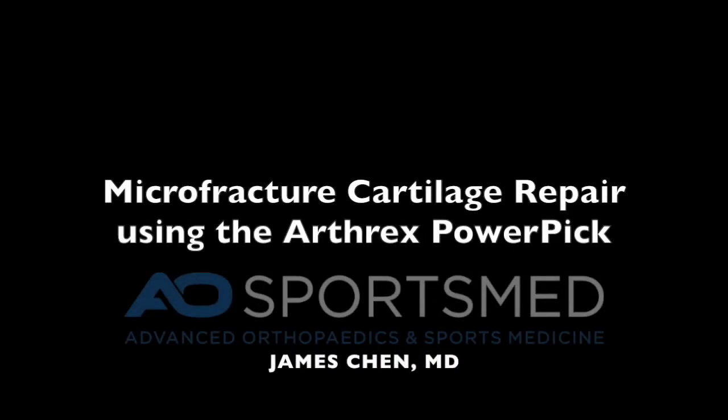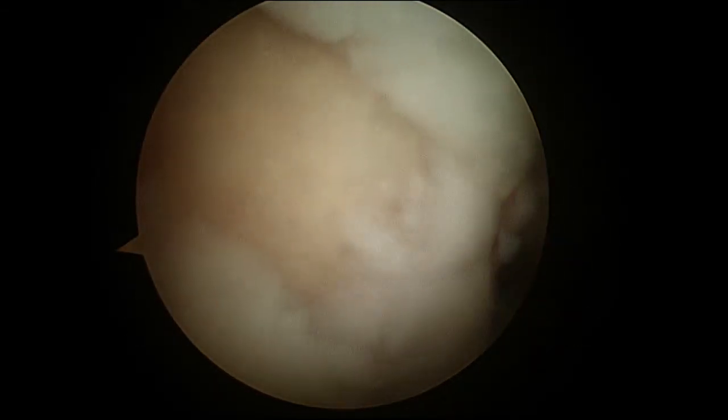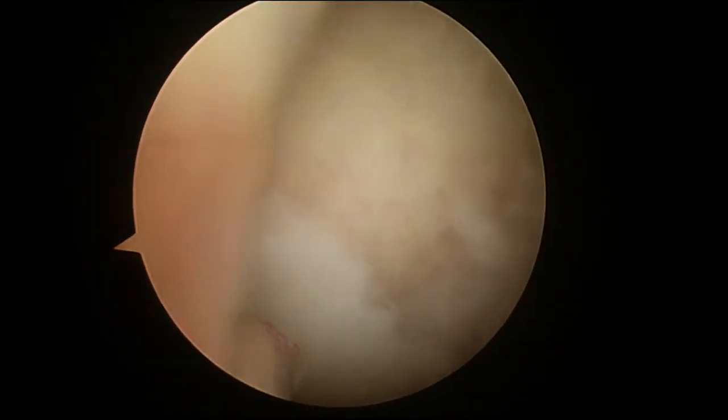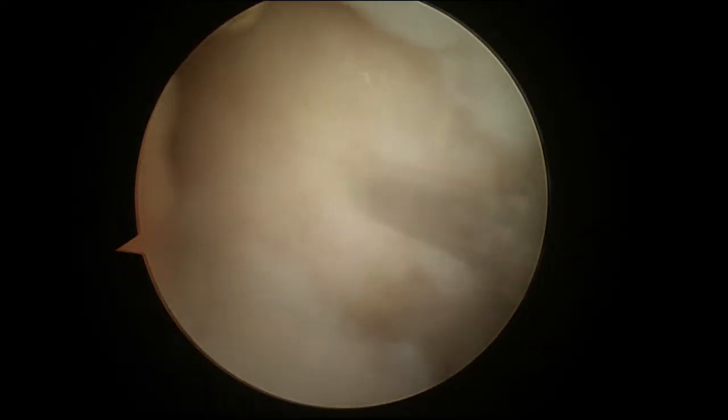This is a technique video on arthroscopic microfracture cartilage repair using the Arthrex PowerPick. Here I am looking in someone's knee through the anterolateral portal and you can see the medial femoral condyle has a large chondral defect.